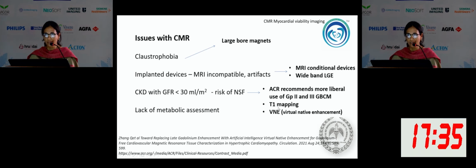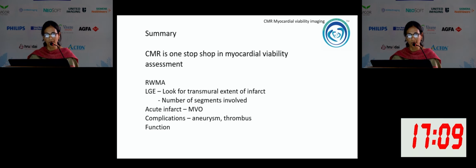Obviously T1 mapping is the other thing, but it is not very specific. And what Dr. Vanessa showed us about virtual native enhancement, with just the T1 mapping and the cine images, we are reconstructing the LGE images. What about lack of metabolic assessment? That was the other point. MR spectroscopy is being developed to try and get more metabolic information also in CMR.